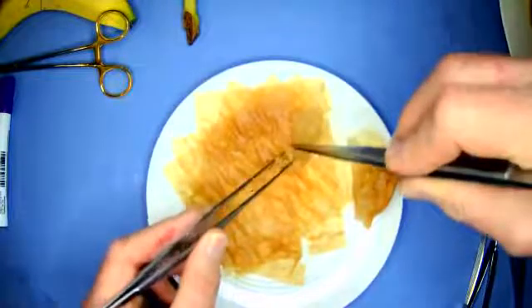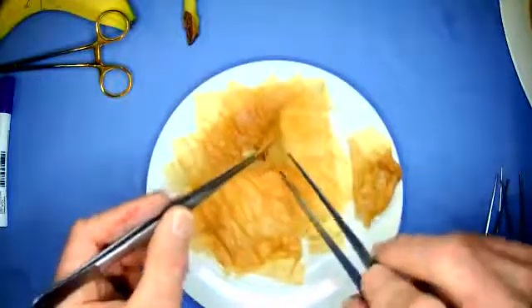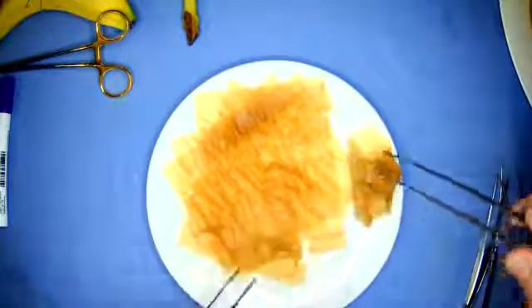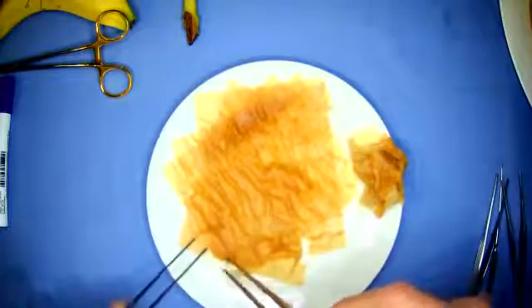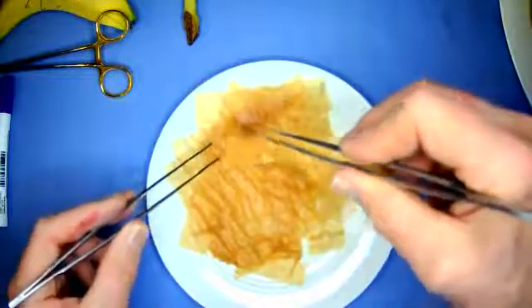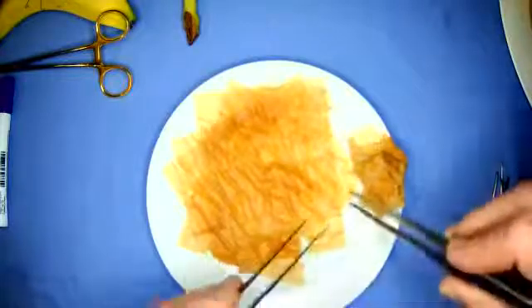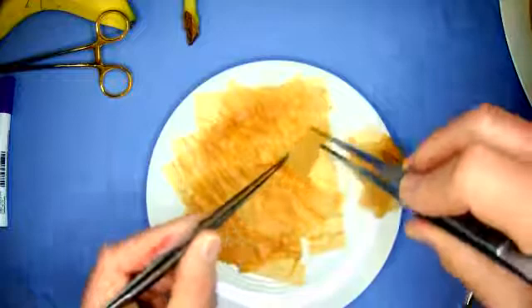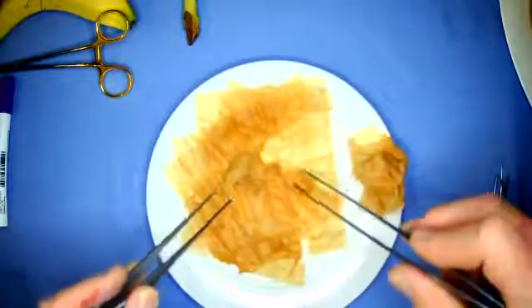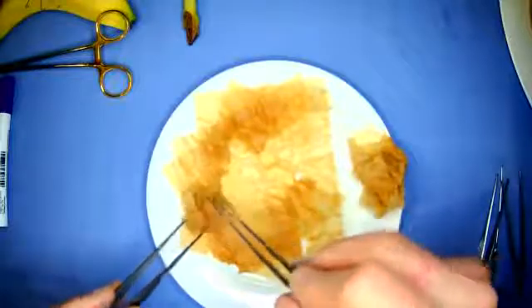Now, I don't expect anybody to get a whole lot off, but what this is doing is teaching you lightness of touch as you try and lift these layers of wet tissue off. And those of you who have done burns or dressings, I can assure you this is not too dissimilar to burnt skin grafts and ulcerated wounds. This sort of tissue you also find in infected cavities. And infected tissue is wet and soggy and very delicate as well. You need to be able to pull them off in layers without doing any damage.